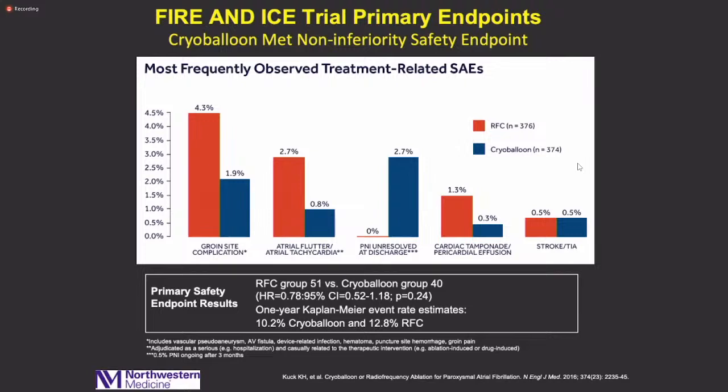All right, so yeah, phrenic nerve injury is the main risk, and we really do everything we can to mitigate that with compound motor action potential monitoring. As soon as we get a freeze at about 60 seconds, I stop pushing to avoid pushing the balloon too close to the phrenic. Making sure that you're not too deep, getting an occlusion with the cryoballoon as proximal as possible before you start to freeze.